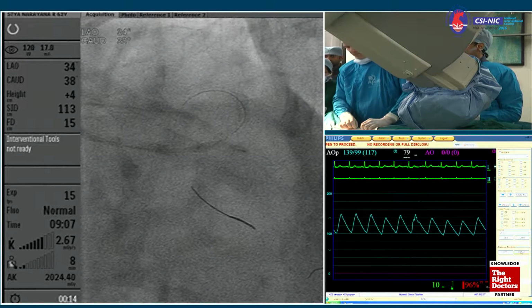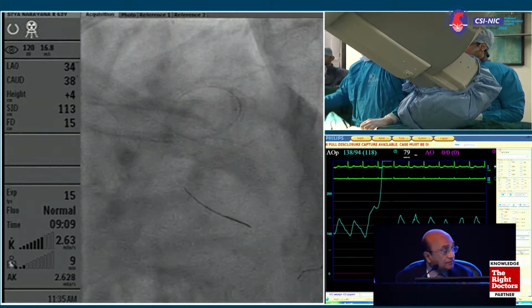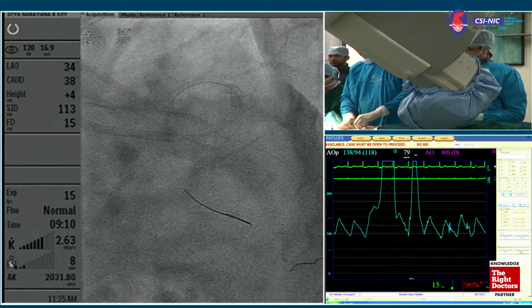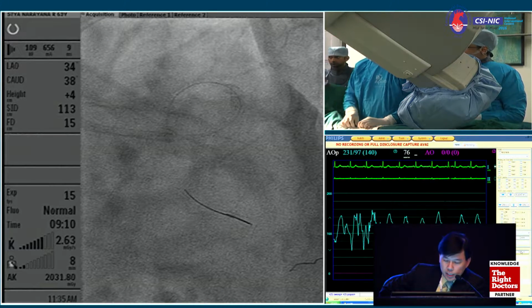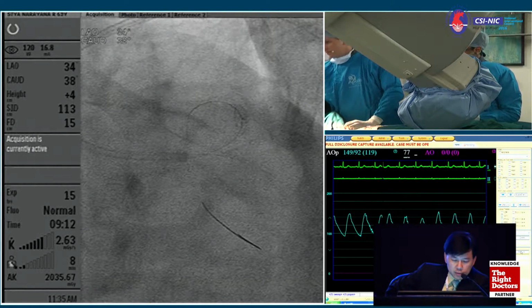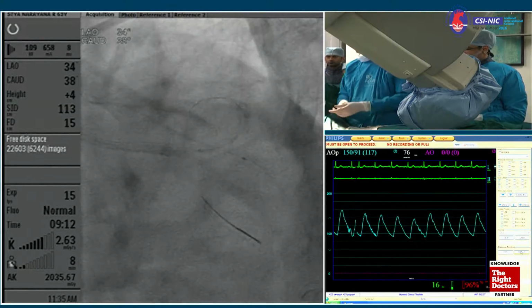Dr. Madekar, Dr. Tan, Dr. Rahman, any comments? Hi, Christoph, this is Hui Chim here. I agree with your strategy of a provisional stent approach for the LAD and diagonal, but probably you will need 2 stents for the distal left main stenosis. My question here is, would you consider some kind of IVUS guidance to help you with sizing and positioning and so forth? Dr. Rahman, what are you thinking about taking the patient for bypass surgery?